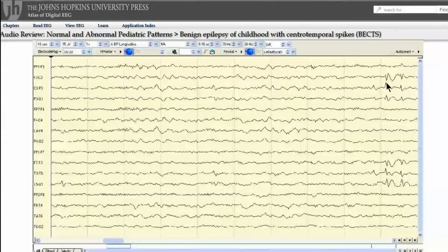Some morphological characteristics that help distinguish Rolandic type spikes from others are that the slow wave is of relatively short duration but well developed. Furthermore, often the field of Rolandic spikes does not spread significantly beyond the very immediate central and temporal region, as these are found deep in the Rolandic and central fissures and do not extend that much laterally.